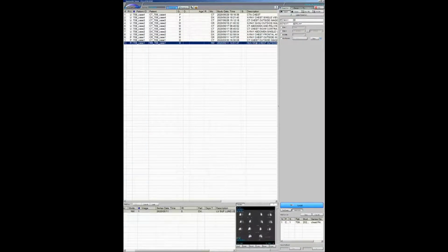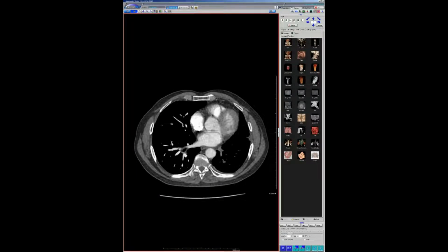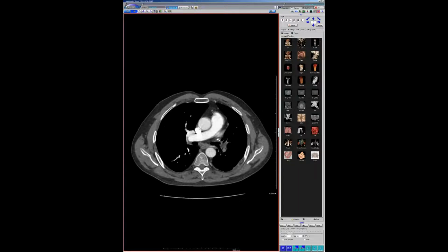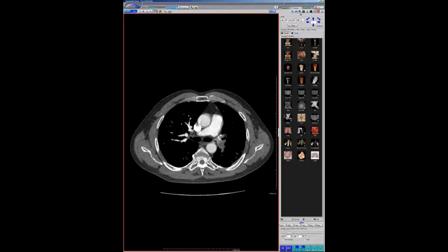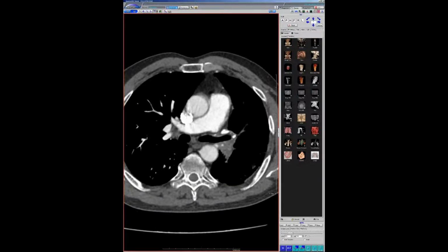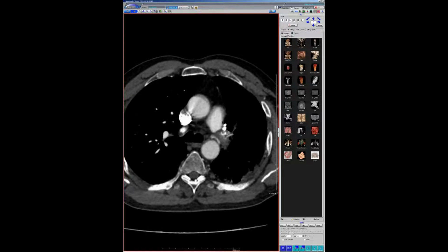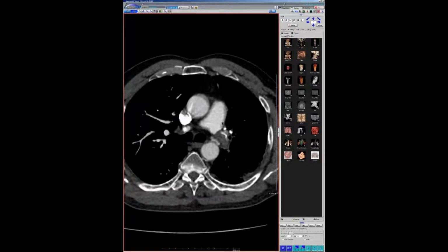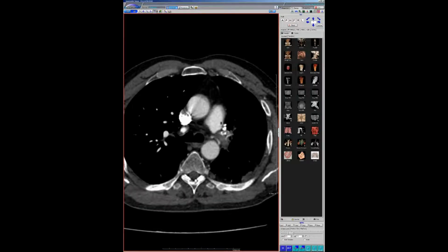He was sent to us. I'm not going to show the nuke med study because even though it's a DICOM, it has some embedded PHI. I'll say that there's nothing in the left lung, no flow. So here's the CT, and you can see that there is a PA, or what's left of it, and it's completely occluded. So then the question is, is this CTEPH? And that's what he was sent here for.